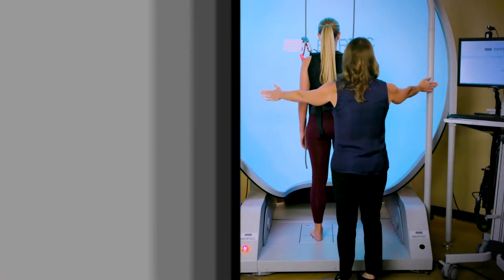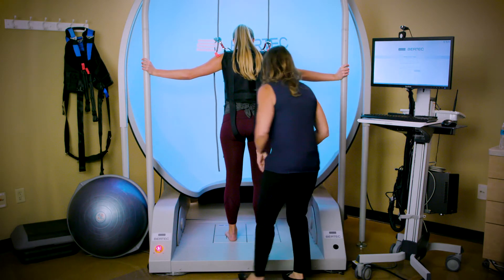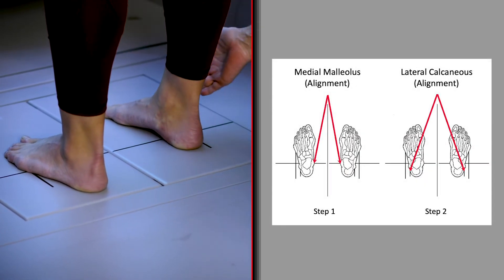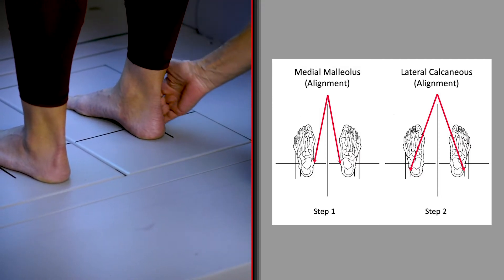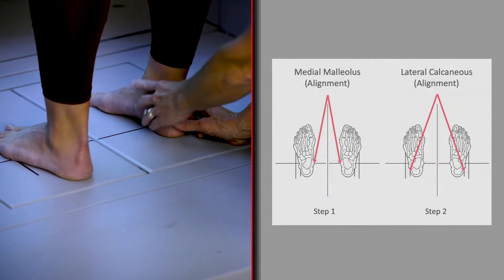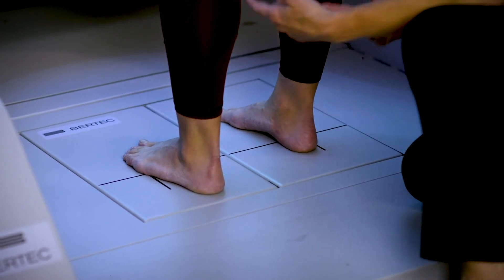I'm going to ask Jackie to hold on to the bars just to keep her balance. Jackie's tall, so her foot is going to be aligned to the large vertical line. I bend down, ask Jackie to lift her right foot, and I place it exactly where I want it — aligning her lateral calcaneus, the outer part of her heel, along the large black vertical line, and her medial malleolus, the inner ankle bone, along the black horizontal line. I use my fingers to confirm alignment, then do the same with the left foot.